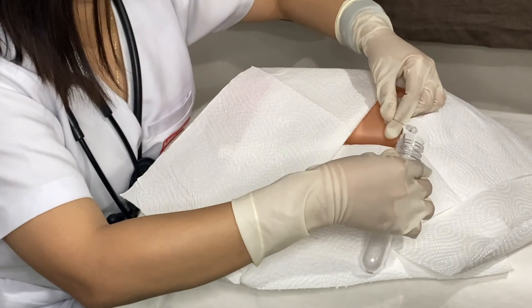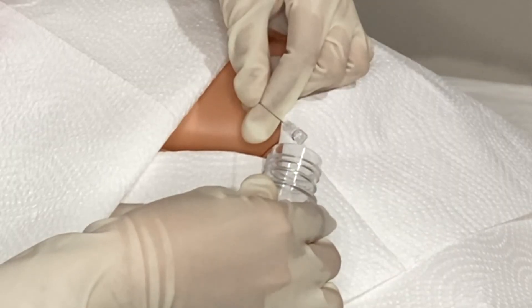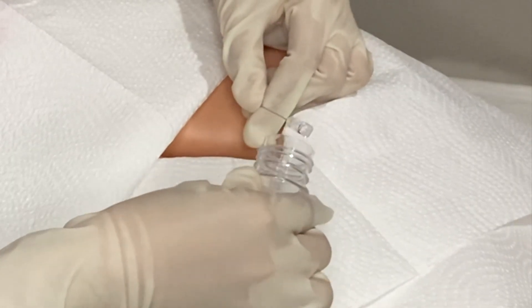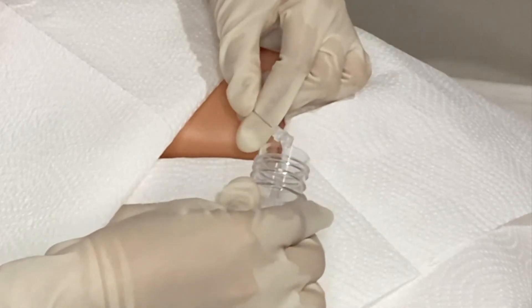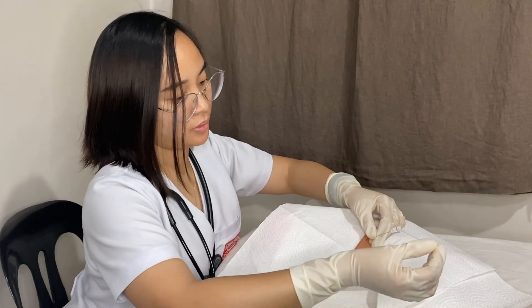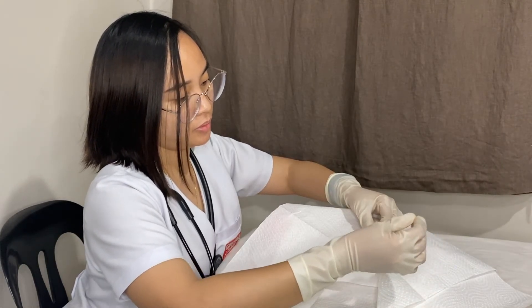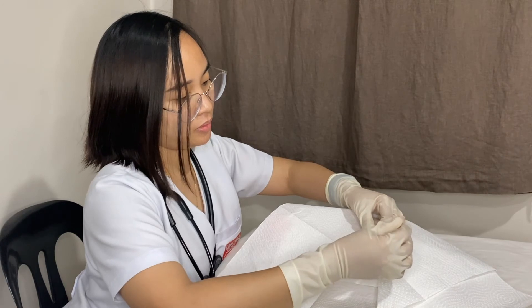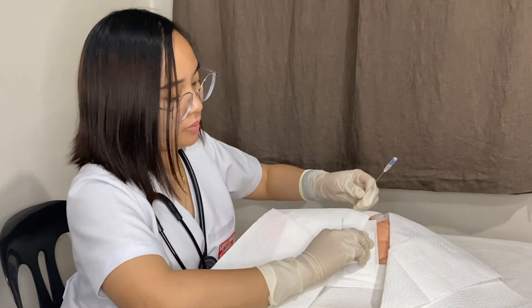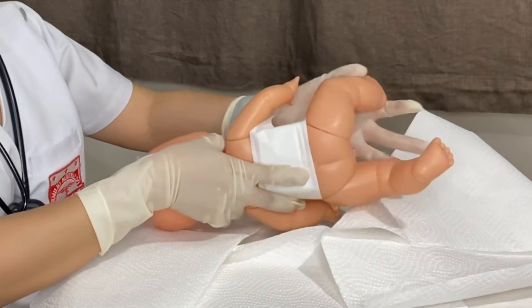Once you have flow, collect the fluid in 3-4 tubes and if possible, about 1 cm in each tube. After collecting all the samples, reinsert the stylet. Take the needle out and put pressure on the site with gauze, then dispose of the sharps.